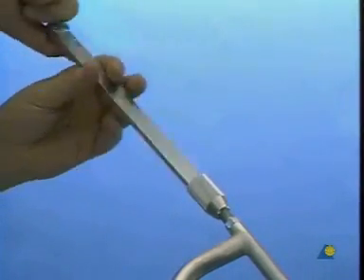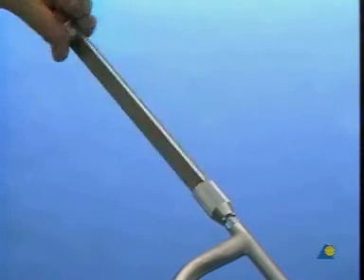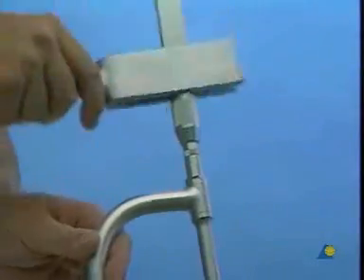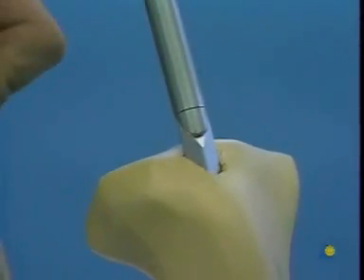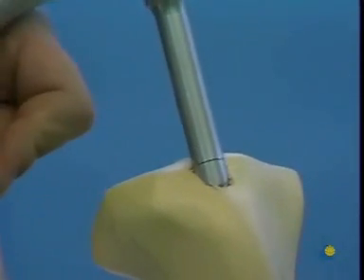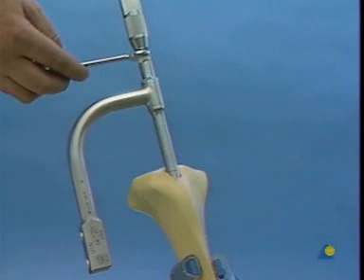In this case, we need the inserter extractor for the UTN. It is screwed onto the proximal thread of the connecting screw and serves to guide the slotted hammer during insertion and extraction of the implant. Having inserted the nail, the inserter extractor assembly is removed.